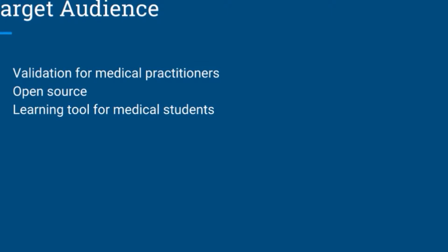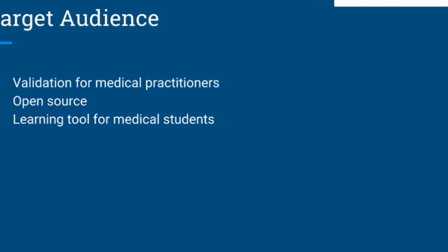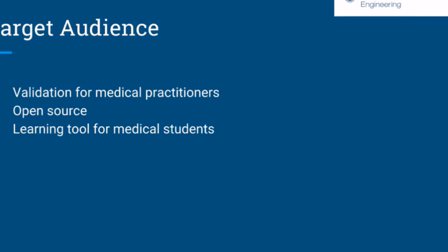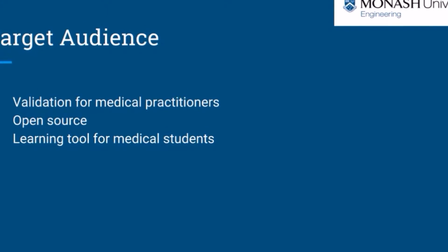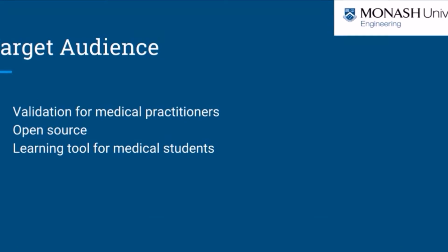So, the target audience for our digital stethoscope project is aimed towards medical practitioners who may want to use the product as a second opinion to validate their diagnosis. Our project is also open source and available to the public. This is especially useful as it becomes a learning tool for medical students.